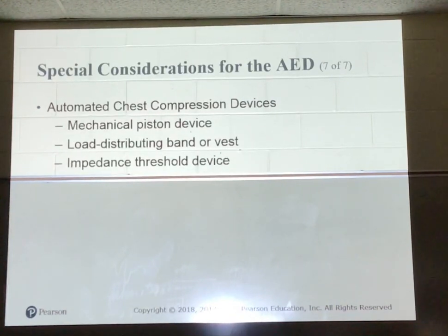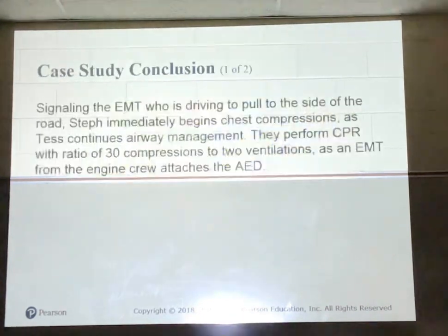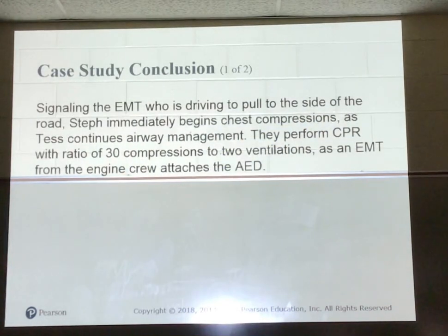Chest compression devices. These are actually pretty cool. We had these at the last place that I worked. It's called a Lucas device. There's several different kinds. It's a mechanical piston. You place it over the chest and it does high quality CPR for you. This is what it looks like.